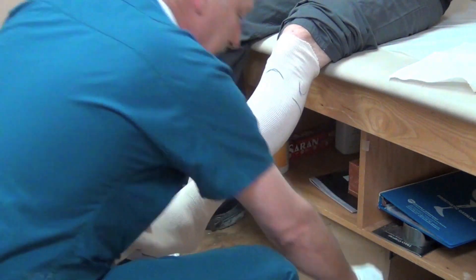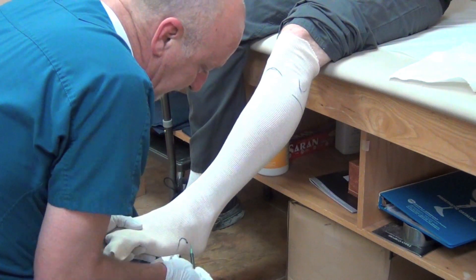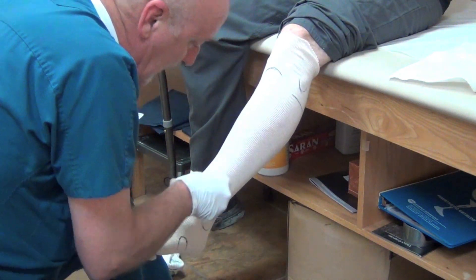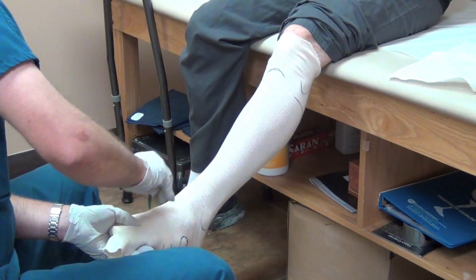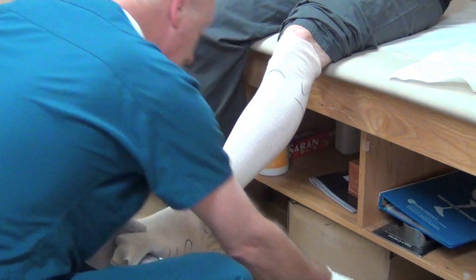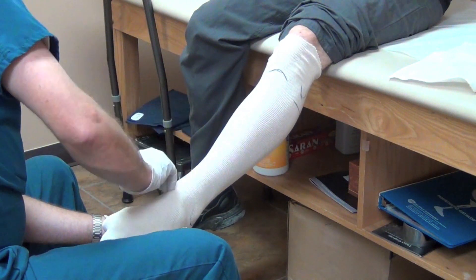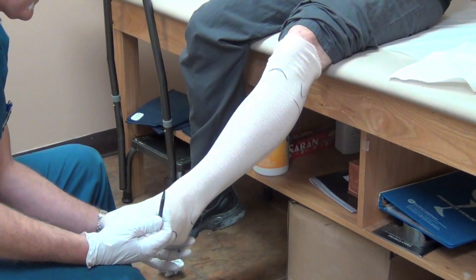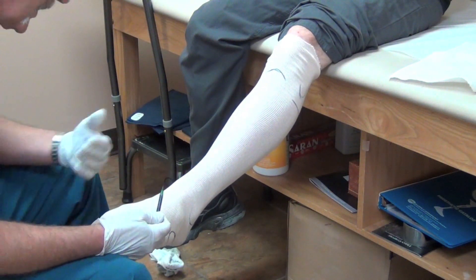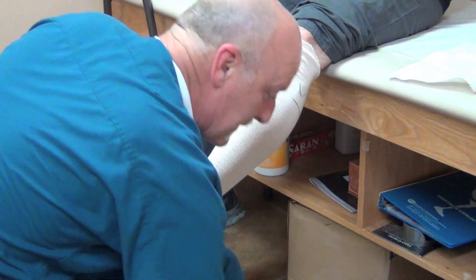I would also prefer that you mark any bony prominences. Going back to school, I'm used to marking the base of the fifth metatarsal, the fifth metatarsal head, first metatarsal head, the navicular, and both malleoli. If there's a Haglund's deformity on the posterior heel or anything else that stands out that you want us to take notice of, please mark it.